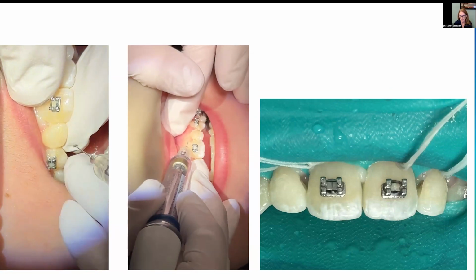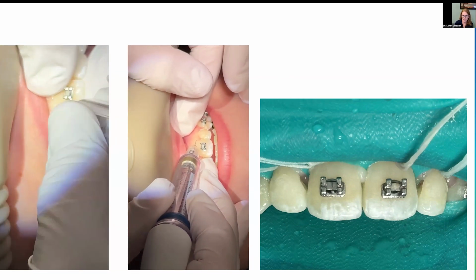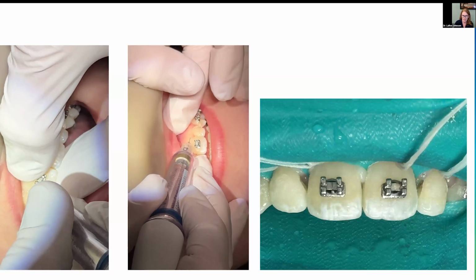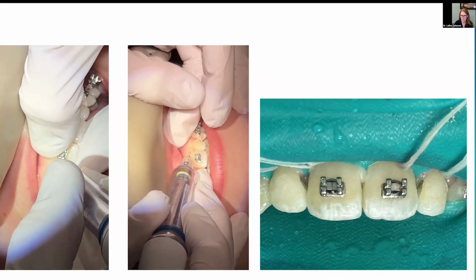I don't want anybody to taste anything. And the D does not matter. The D doesn't have to face out at this point. And then you can see the little rotate, rotate, rotate, and then it drops in. And you can see the other one. And I must have come out to try to get another little go at it.